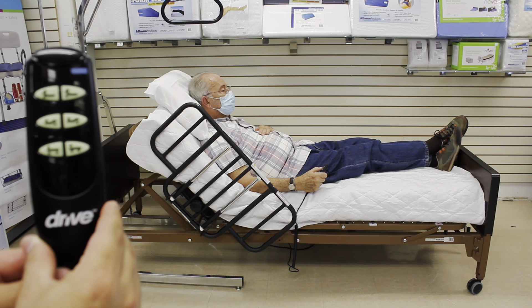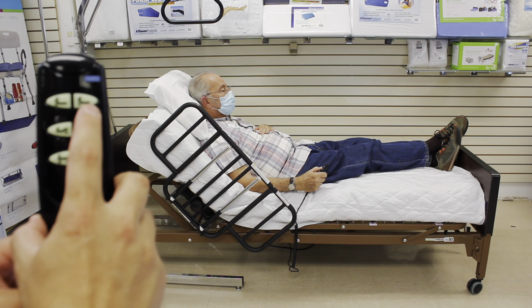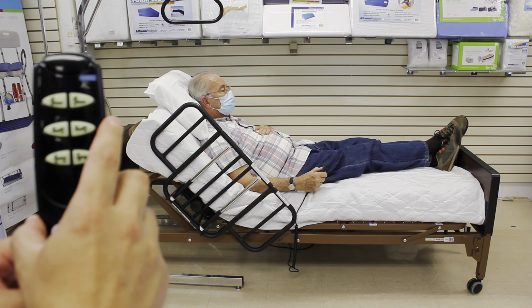Now, pushing the second top button will move the head of the bed down.